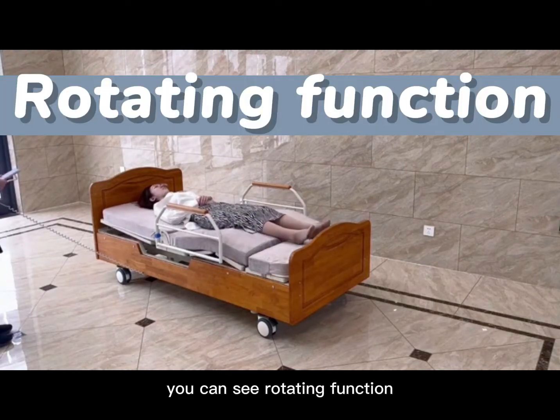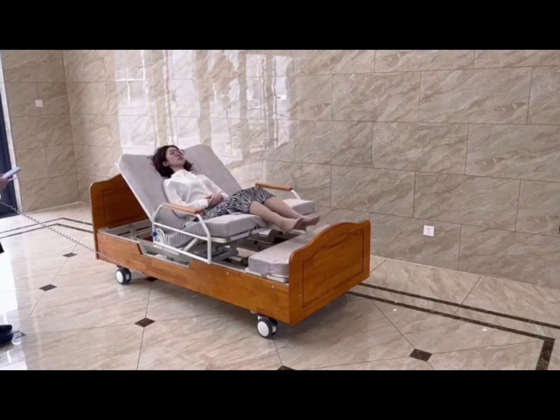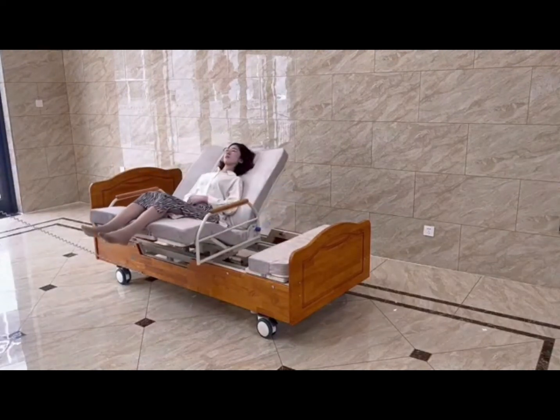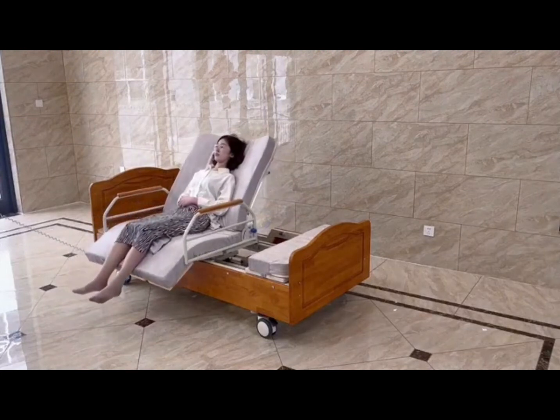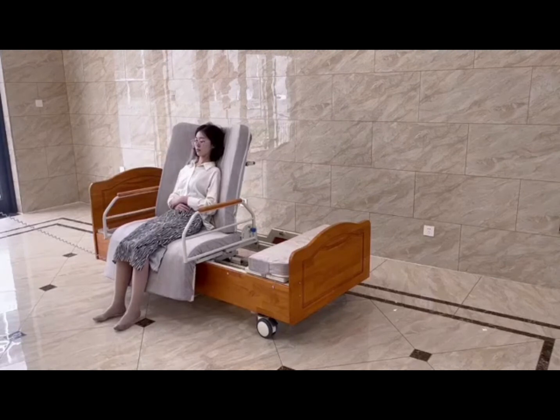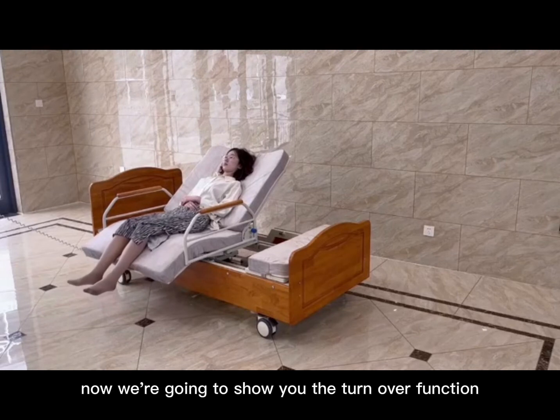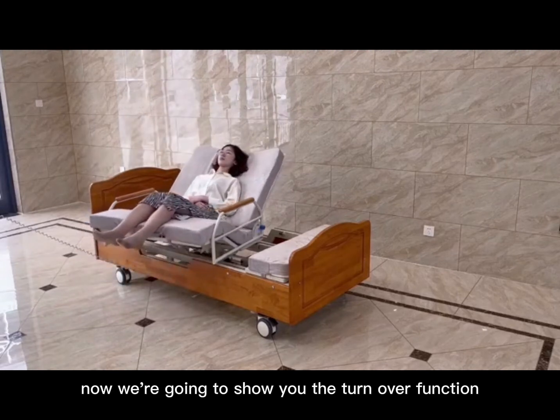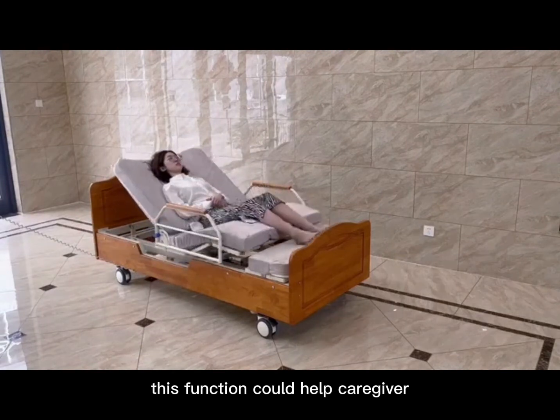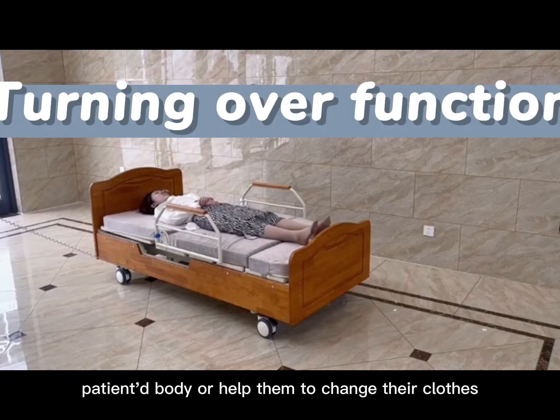Here comes the rotating function. Now we're going to show you the turn over function. This function could help caregivers to clean the patient's body or help them to change their clothes.